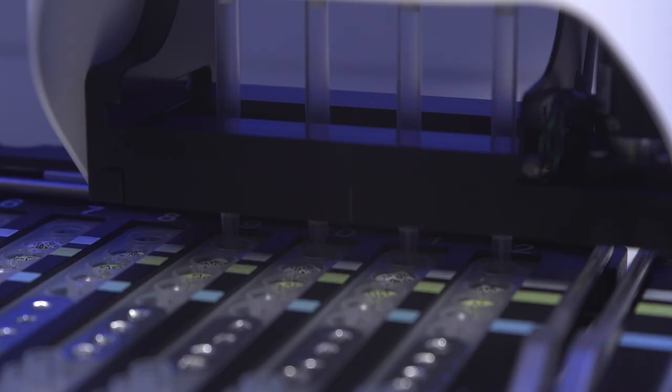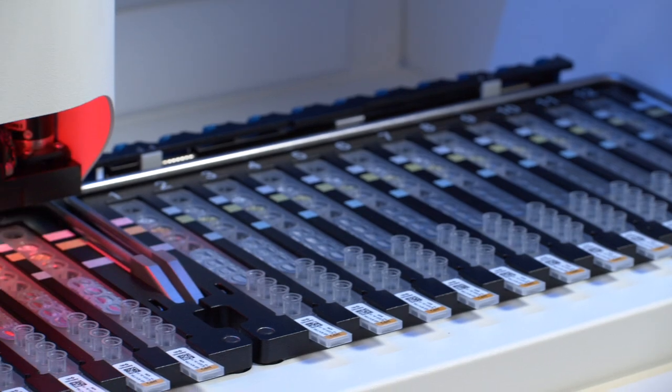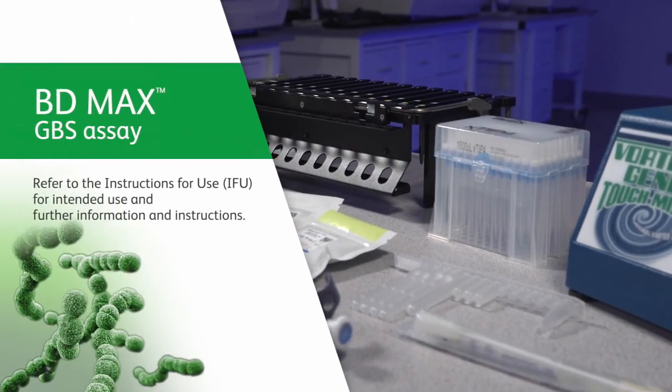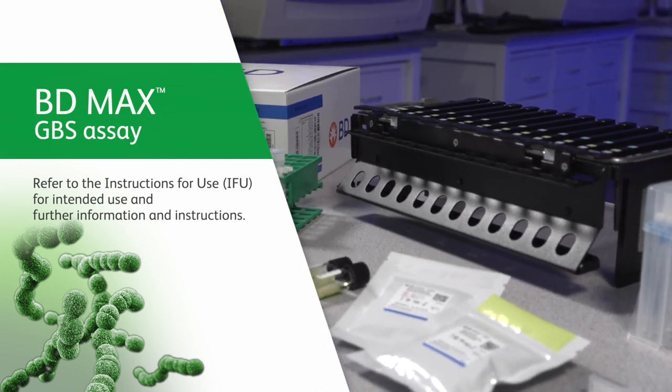The BD-MAX system automates sample extraction, nucleic acid amplification, and detection of the target nucleic acid using real-time polymerase chain reaction, PCR. For a full list of equipment and materials required but not provided, please refer to the instructions for use.